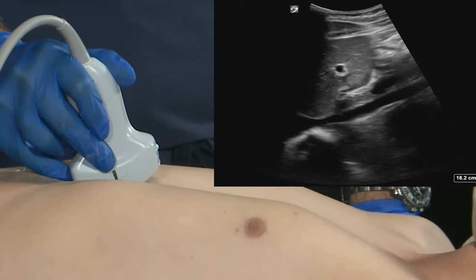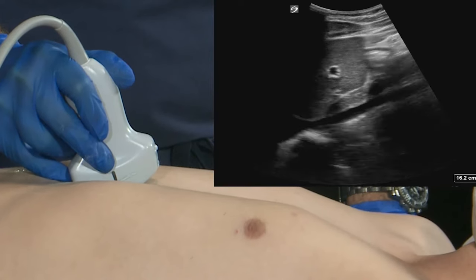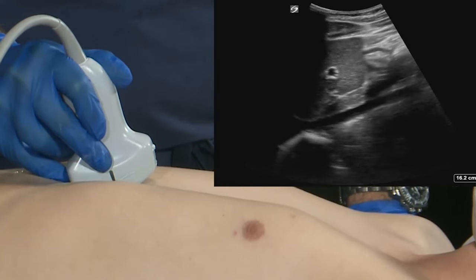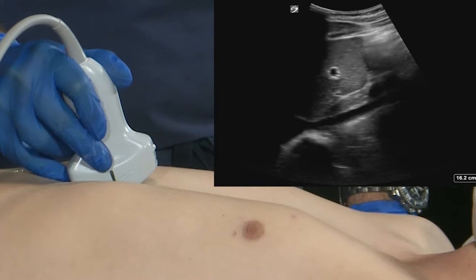Transducer orientations are generally described in one of two ways. If the marker dot is pointed towards the patient's head, it is in the sagittal plane of the body, or sometimes referred to as the long axis of the body.